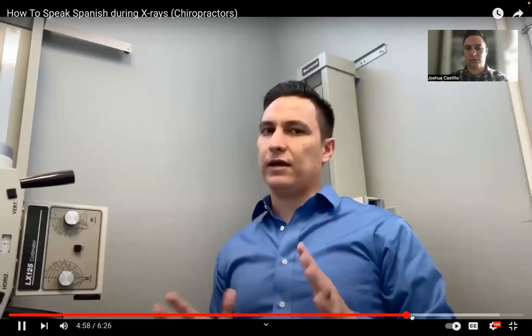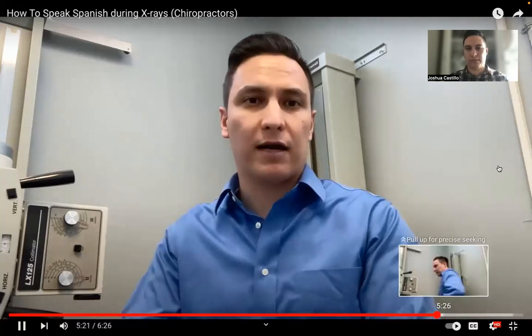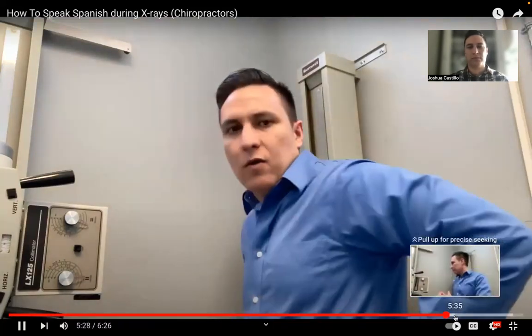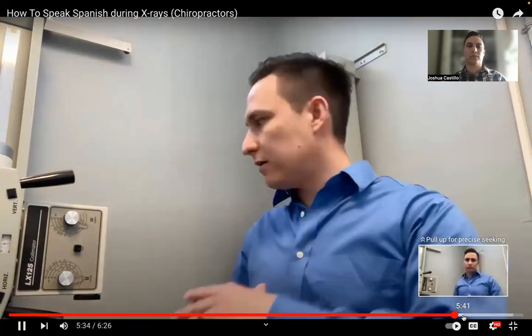Weird. And that's because I'm a guy. Now, if I'm a girl, right, I play that by ear, but you're never going to be wrong if you say, oh, okay, voy a tocar aquí, voy a checar el nivel de las caderas, because I like to check hips. I like to check a little bit higher up to see where the small of the side lumbar is to position the lateral lumbars, and then I move up the bucky or the collimator a little bit to get that side view of the lumbar.